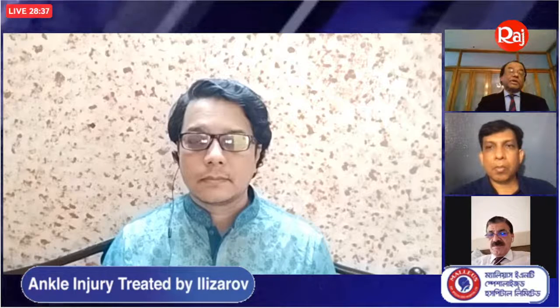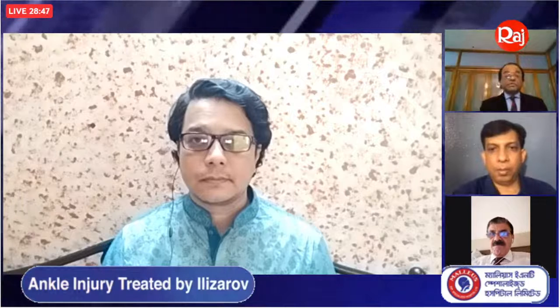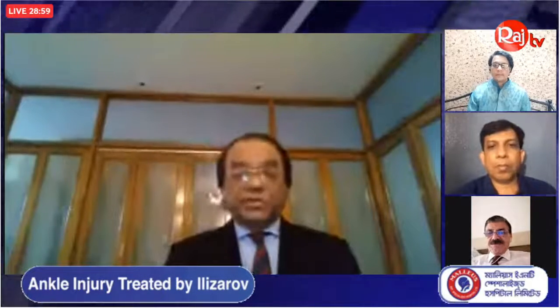And in the Ilizarov principle, what Ilizarov said is that everything must be done gradually. This is the principle of Ilizarov. And this apparatus always gives you ligamentotaxis. That means you can distract gradually without hampering any soft tissue or vessels. So this is the beauty of Ilizarov. Thank you so much.